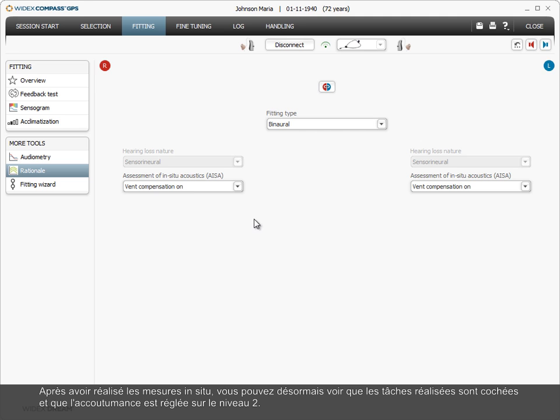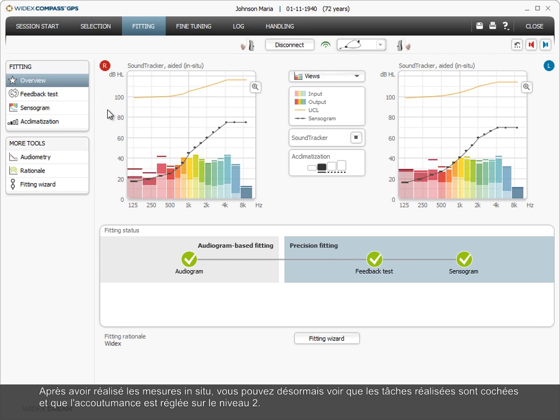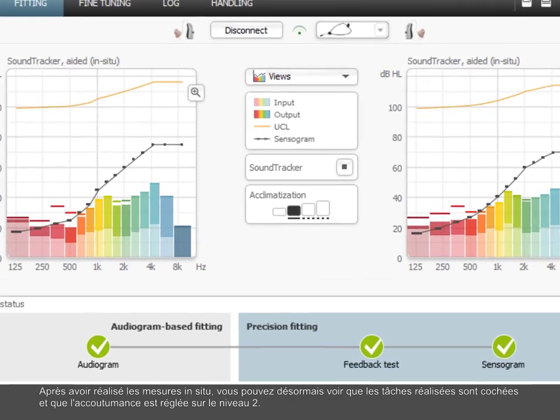After completion of the in-situ measurements, you can now see the check marks for the tasks performed and that the acclimatization is set to level 2.